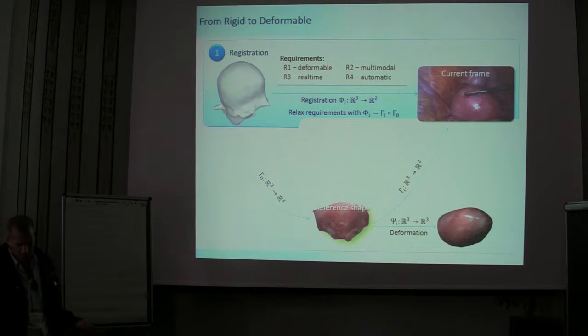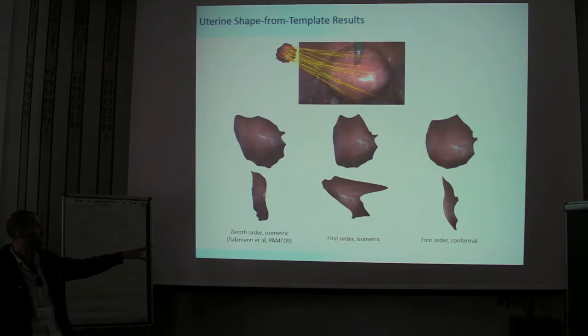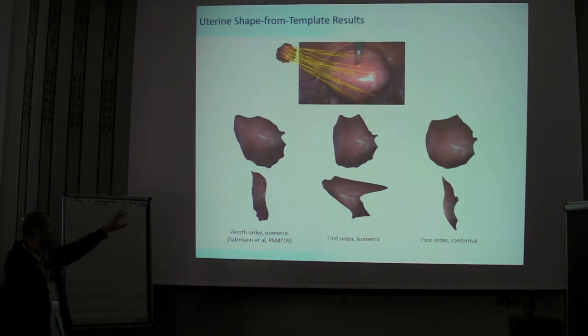that's missing the point. So we want to apply shape from template because this is exactly the setup of shape from template. And we've done some very preliminary tests, so that on the left, this small thing is the flattened uterus, visually, physically flattened, which serves as the template.